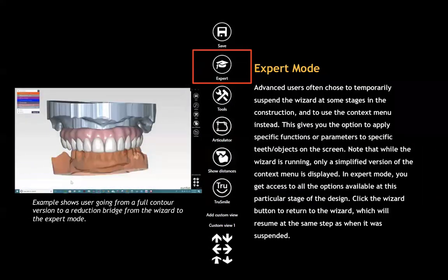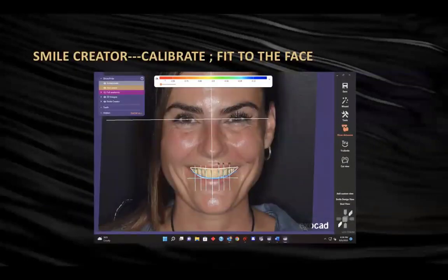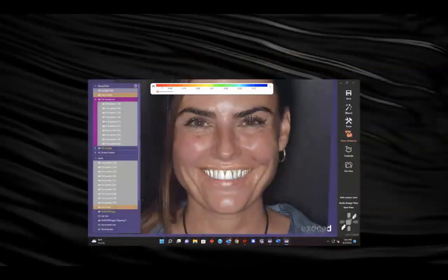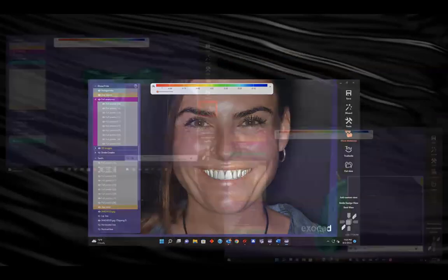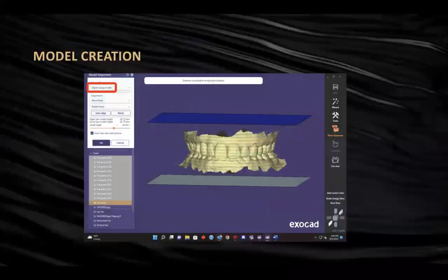I like this as an adjunct to doing the wizard, and I create that wax up, and then I just kind of fit it into the face. And this was great for my lab technician to see, but also it was great for Kelly to say, okay, hey, I like where this is going. And with Kelly, she was very, very concerned that I was going to take away any tooth structure. So I was able to show her right here that we weren't going to take away much tooth structure, really going to take off the veneers and just kind of adjust the gums and create some better margin. And then I expand her smile into the bicuspids because I want her to have a big, broad smile.